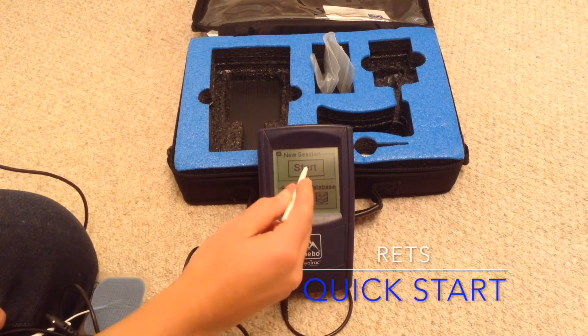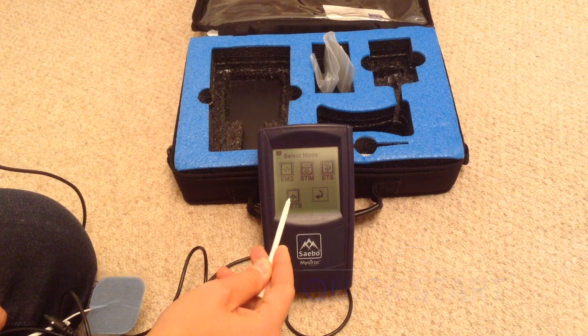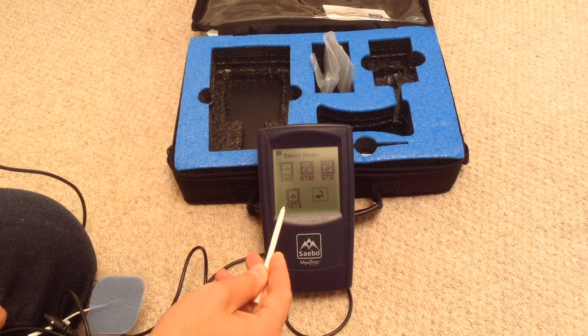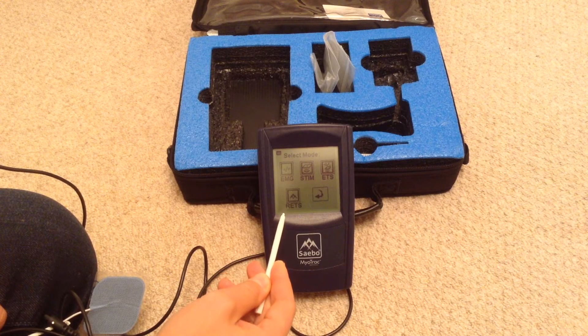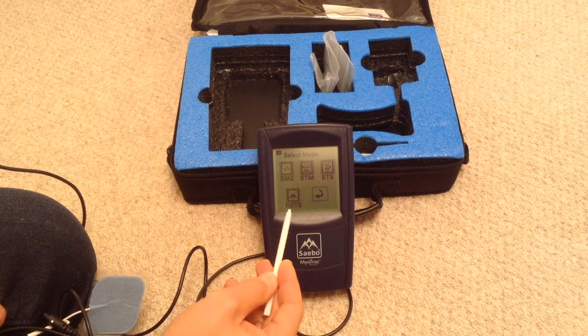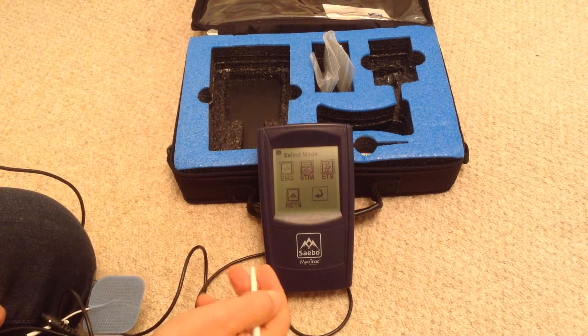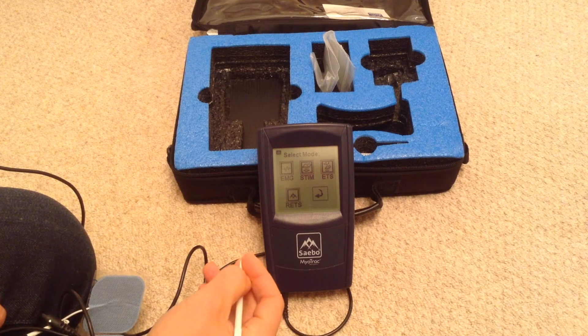If I want to use the reciprocal program, I'm going to start. So this is the RETS program, which is reciprocal EMG triggered stimulation. Clinically, I would use this with patients who I want to try and help to switch off their overactive flexors before they can activate their extensors.